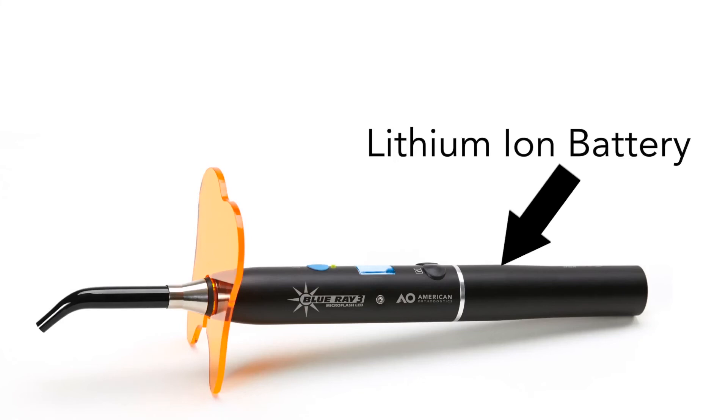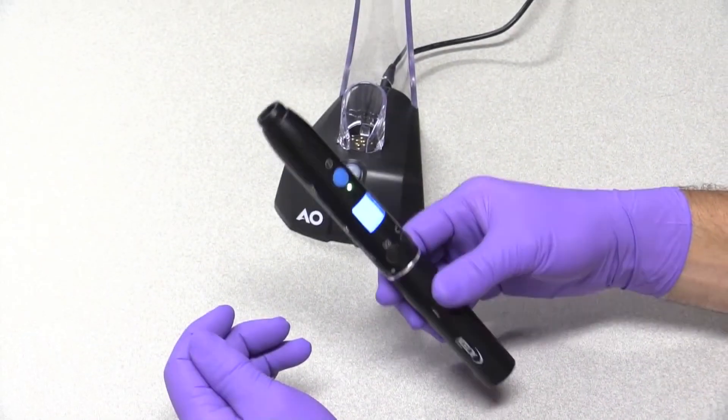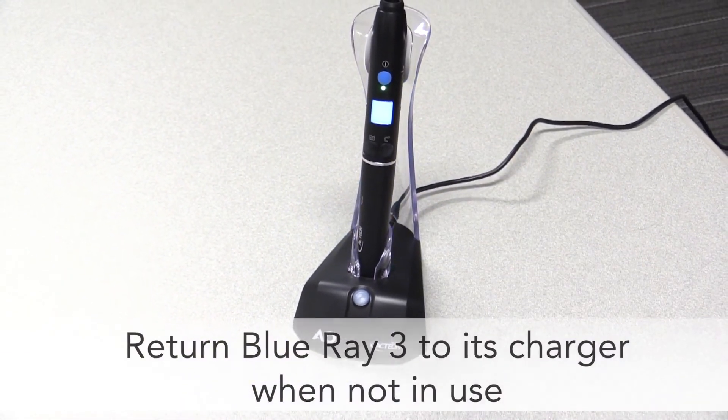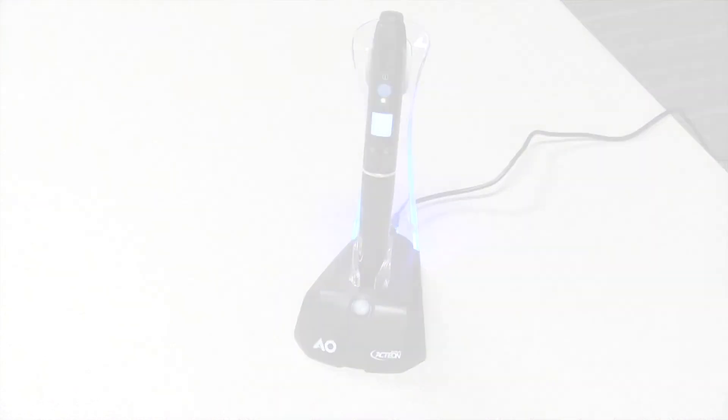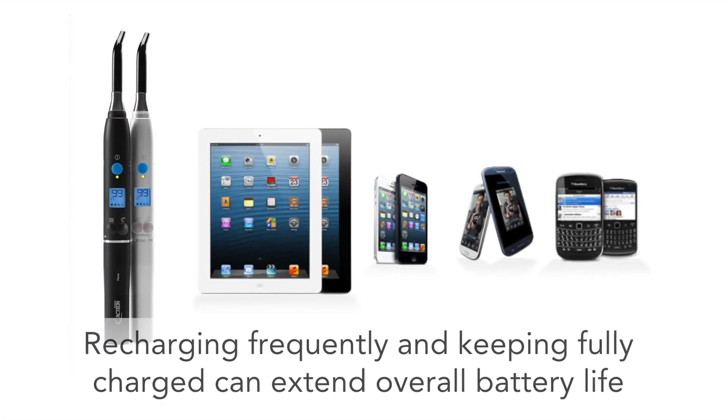Recharging this type of battery frequently and keeping it fully charged as possible can greatly extend the overall battery life. Return your Blu-ray 3 to its charger whenever you're not using it — many other small appliances like cell phones and tablets also use lithium ion batteries and similar advice holds true.